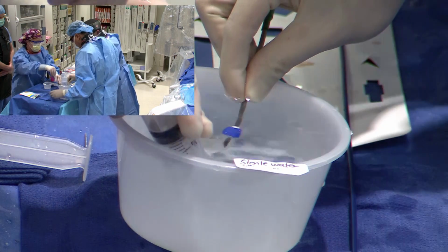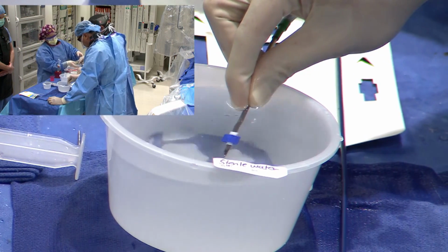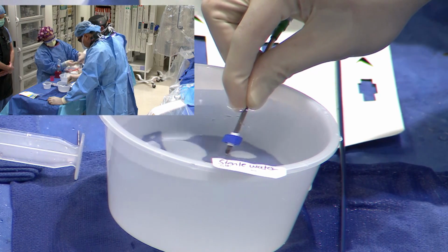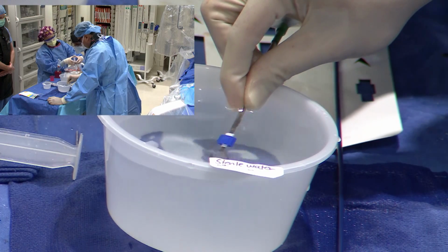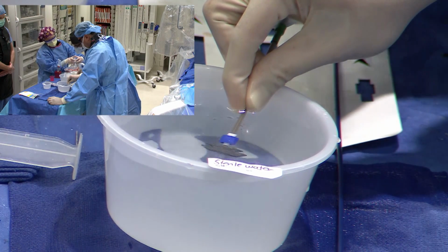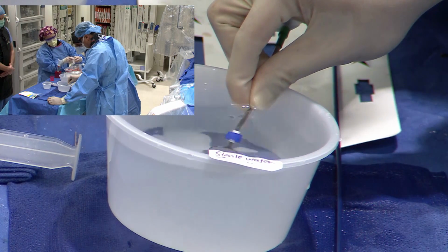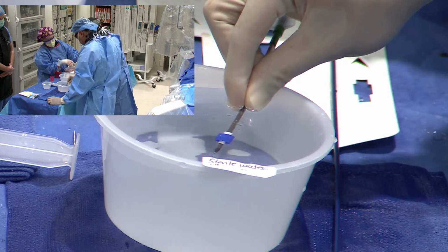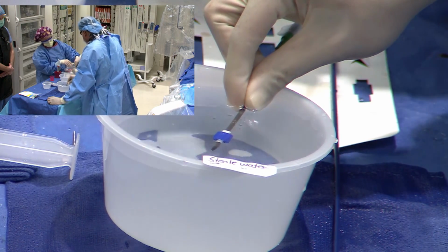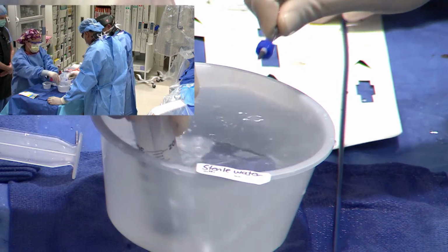This is the exercise to make sure there's no air in there, and the device is pretty nicely flushed. Okay, so I want you to pulse it for me. Poof, poof, poof. Okay, perfect. Stop. Looks pretty good. And load it up one more time. So that's just de-airing the device, nothing special.